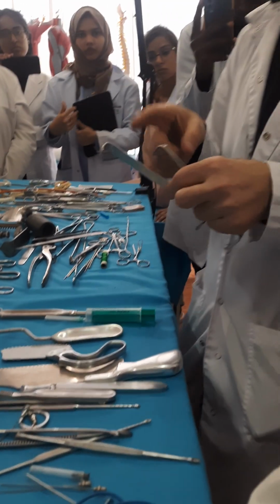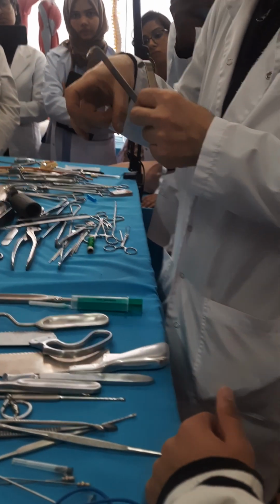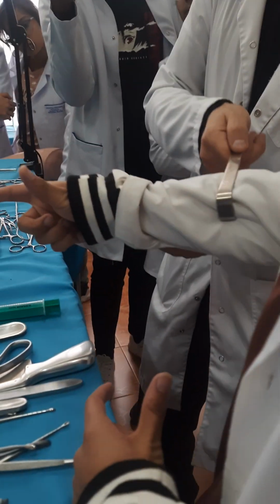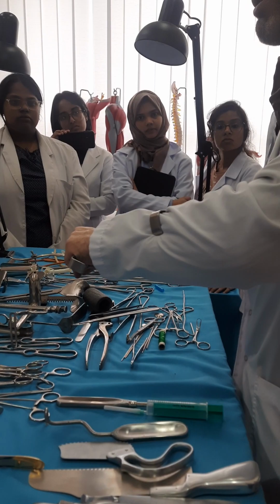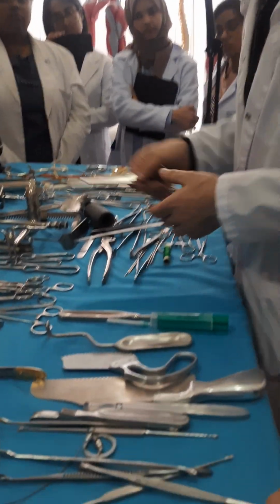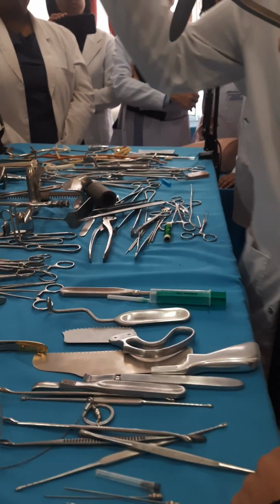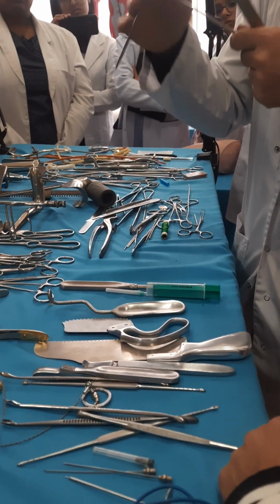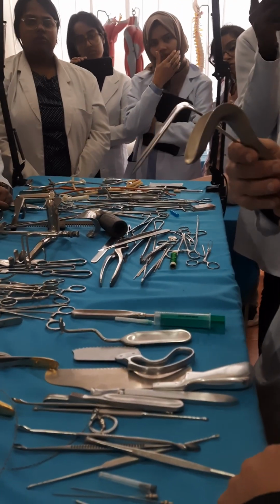You can see it has 2 tips. One is short, the second is long, and both are curved inside. If you see a hook which is curved inside, remember it is for the wall. It is not for an internal organ, because it will be ruptured. Vice versa, if you see hooks which are moved by margins outside, or which have an absolutely smooth surface without any hook-shaped form, it is for internal organs.